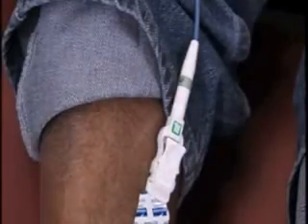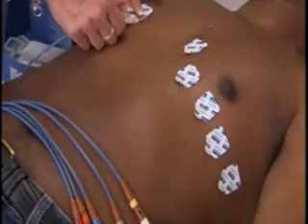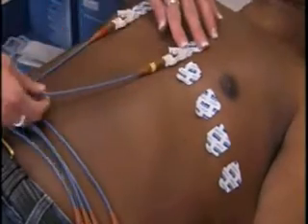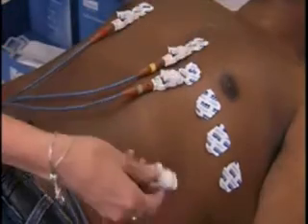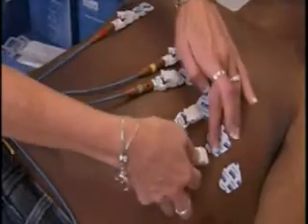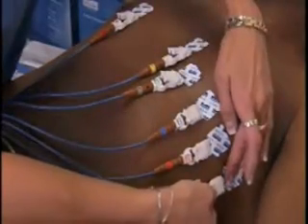One other helpful feature of the IQ ECG is the stat ECG feature. You can hook up a patient and run a stat ECG right from the IQ Manager main opening screen. Once you complete the test, you can save and/or print the report by clicking on the analyze button. You will be prompted to enter the patient information when you click on the report review button.